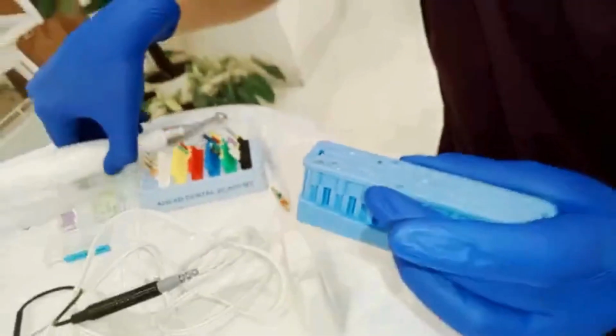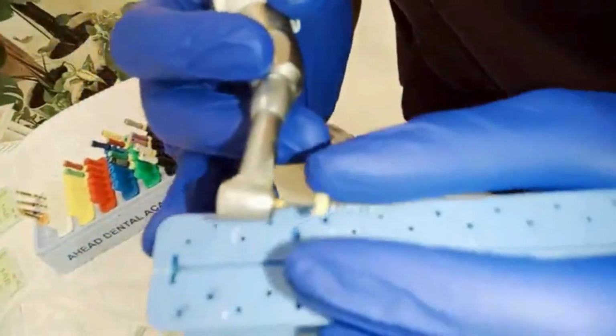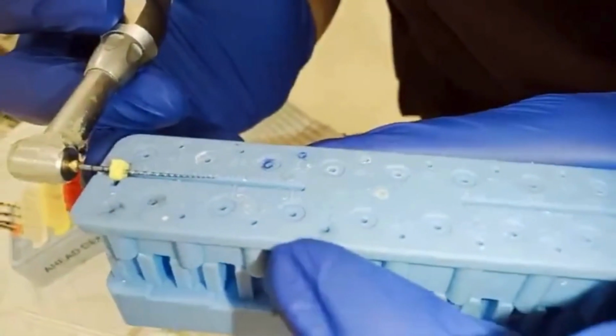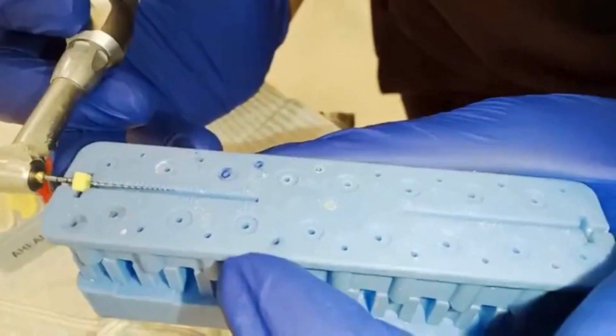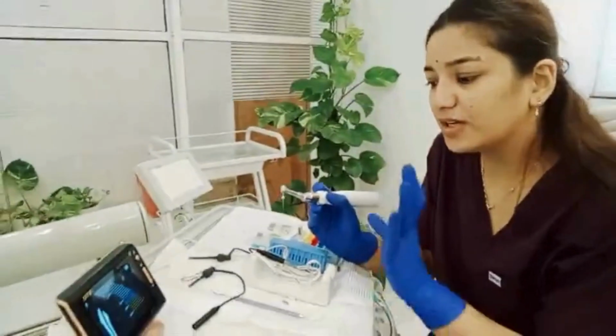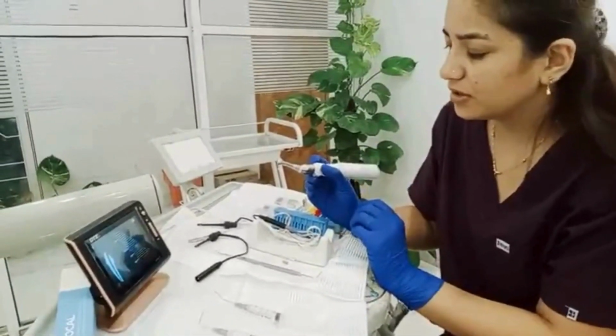Okay, so then we'll mark this stopper at 17 only, not beyond that, not short of that. So this is 17 I have marked here. Okay, so now we'll go in crown down portion only. We'll use crown down technique. So it is endomotor.